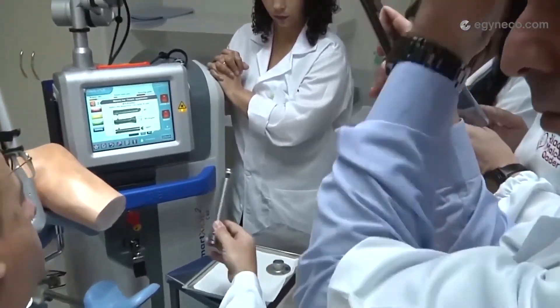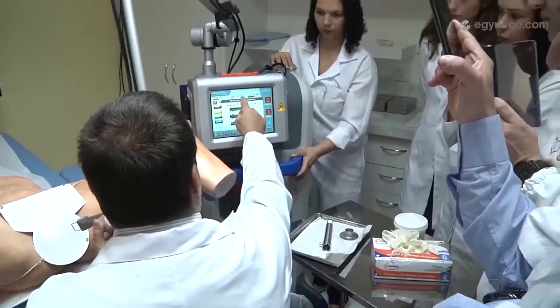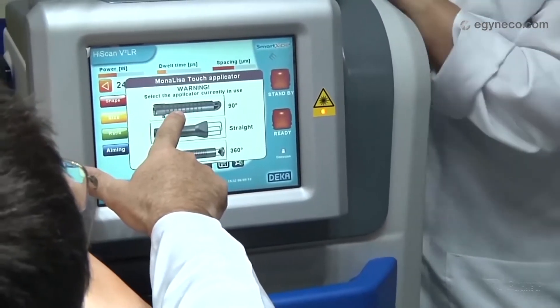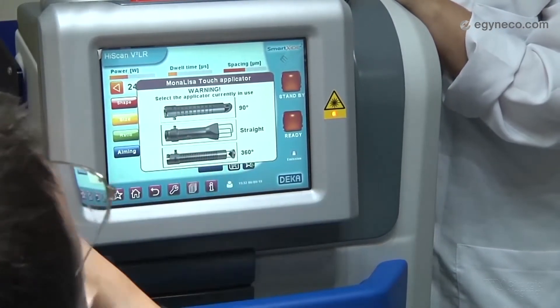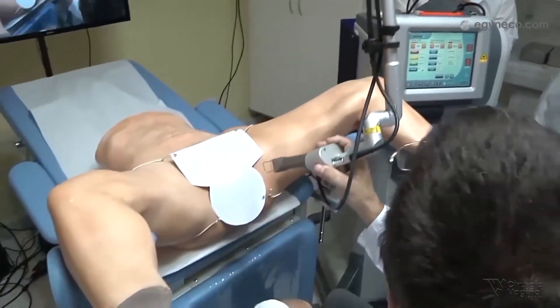This is the handpiece for the Mona Lisa Touch. We choose the handpiece applicator that we need — the 90-degree for incontinence. Now we chose the dermatologic handpiece.